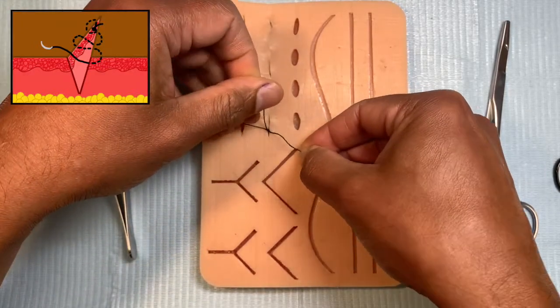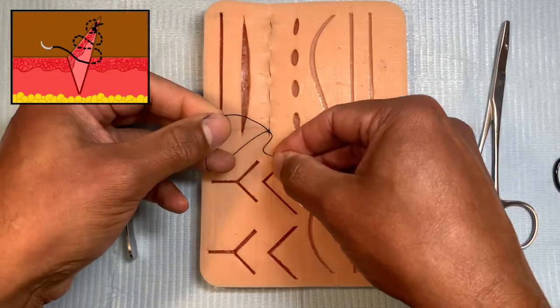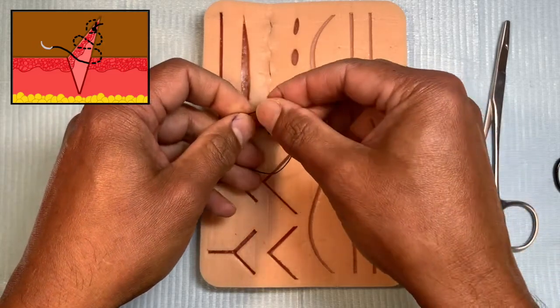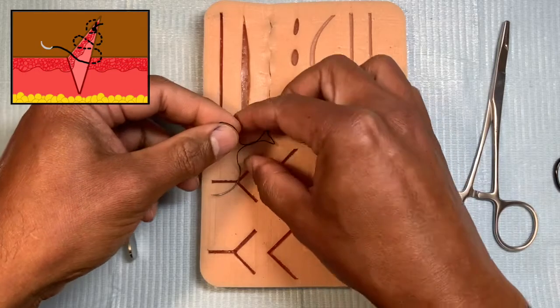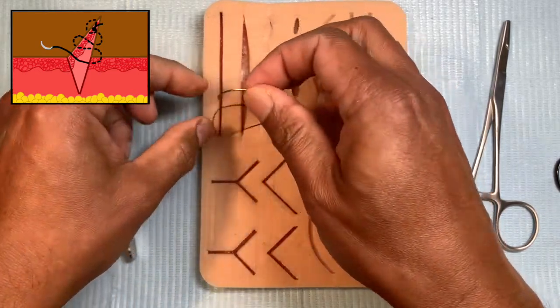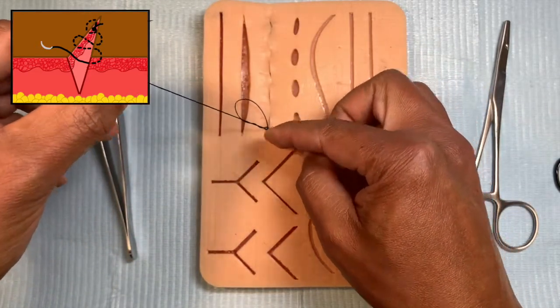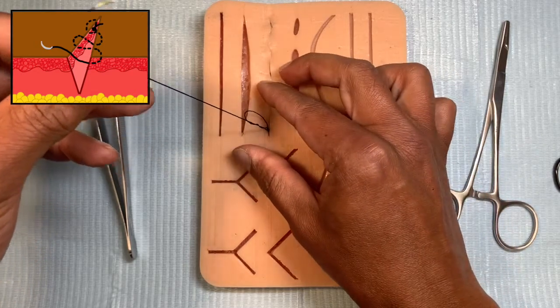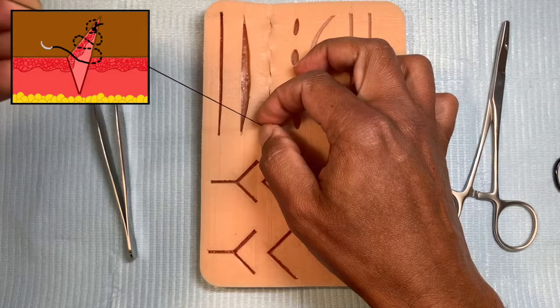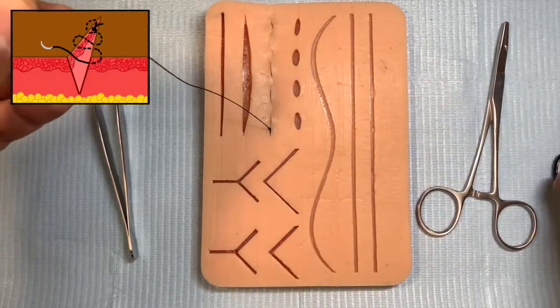This is already creating the knot. Now it has to be locked in, so once you run these three loops, you pass this needle twice through this loop, once and then one more time. You've got the three loops initially and then the two pass-throughs of the needle, then you just pull it and make sure all the knot is completely together and nicely locked in.